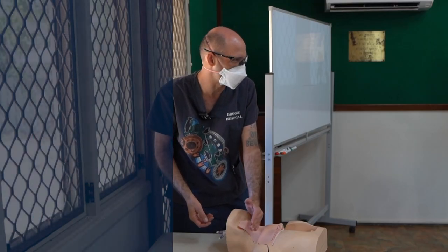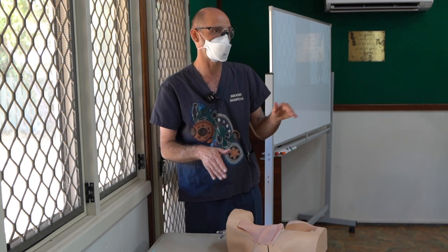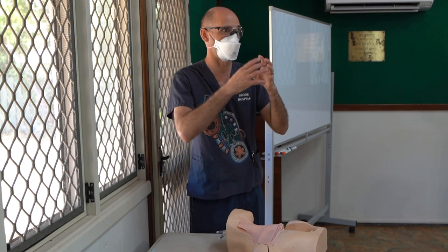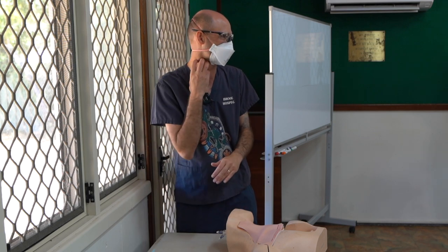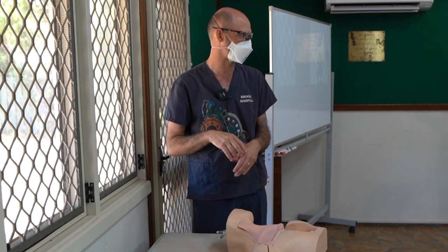A couple of tricks if you're finding it difficult: you can put the patient head-down a little bit. You can get them to do a Valsalva — what will happen with a Valsalva? It'll blow the vein open. And you can push down gently on it, and you'll see the carotid very clearly over your internal jugular, even if it's a weak pulse.